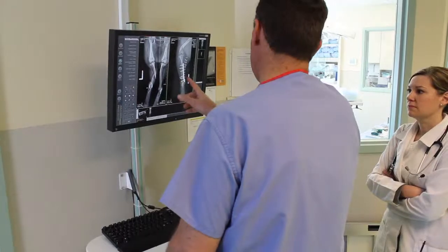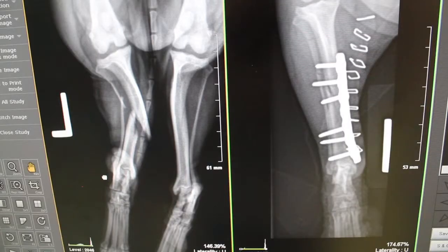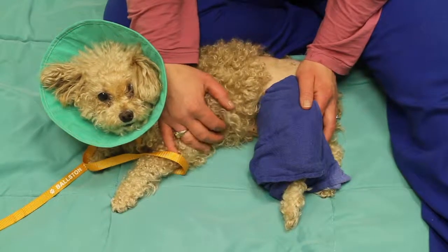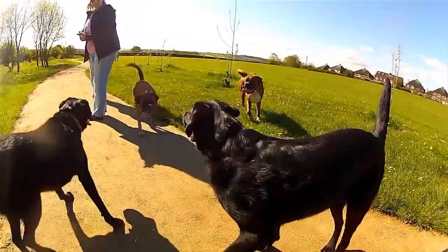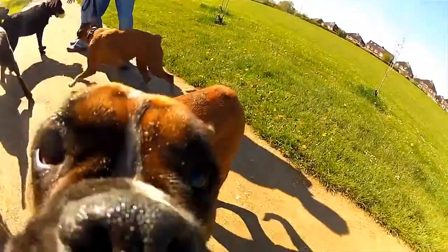Post-operative x-rays are taken to confirm good screw placement, and the wound is iced and lasered. Dr. Anderson's patients typically start walking on the repaired leg three to five days after surgery.